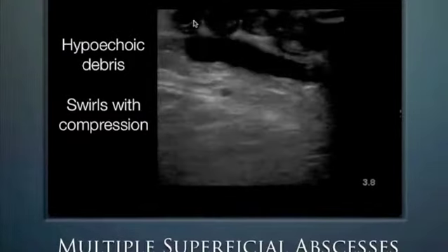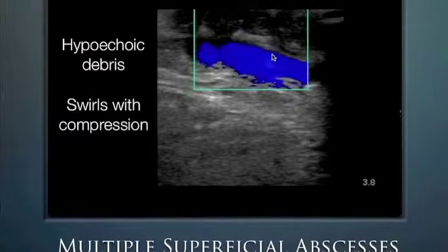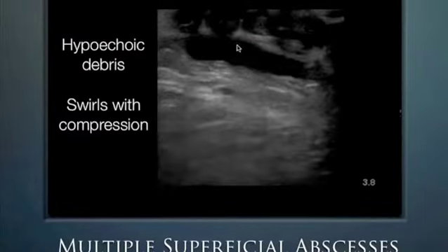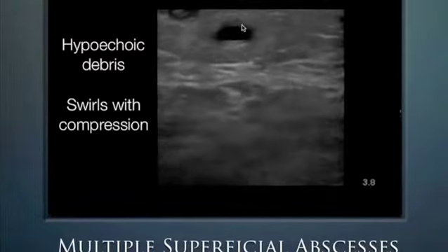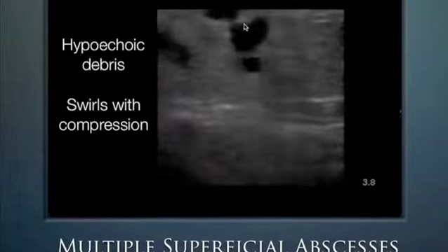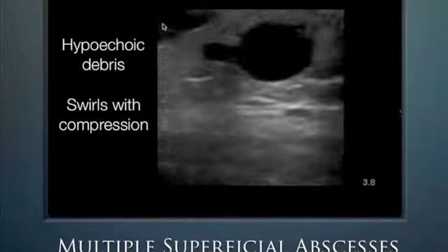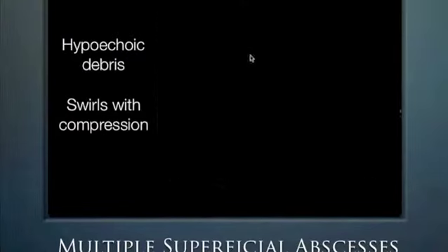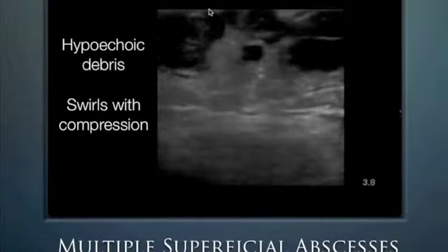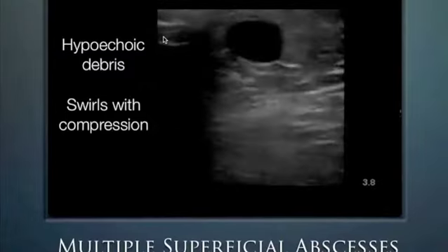And this patient has multiple little abscesses along here, right adjacent to this vascular structure when we apply the color flow Doppler. And so this was a very tricky one. We wanted to drain it, but stay clear away from the vascularity and just get into the abscess only. And we can see this network of abscesses here as they're going along, and with various areas of vascularity that we're trying to stay away from. And ultrasound is good because it helps us really focus ourselves on staying within the compartment of the abscess and not getting into the vessels.